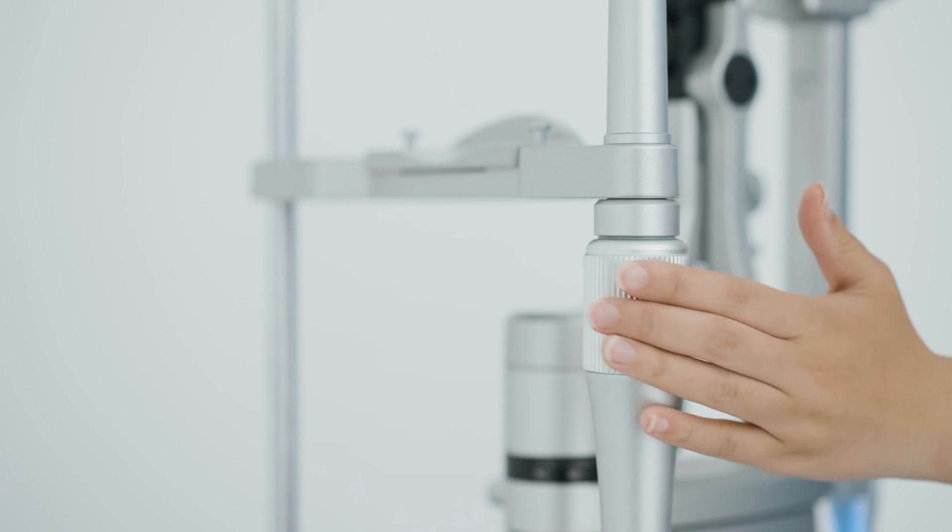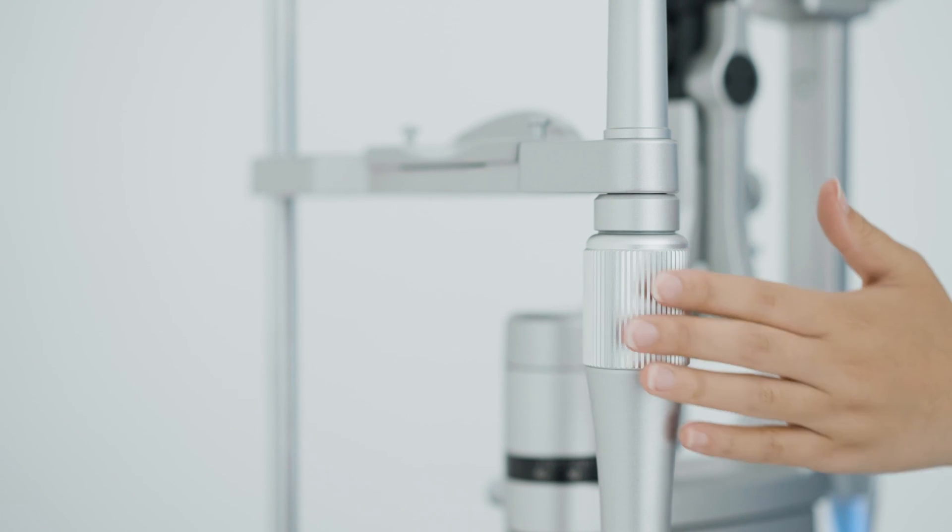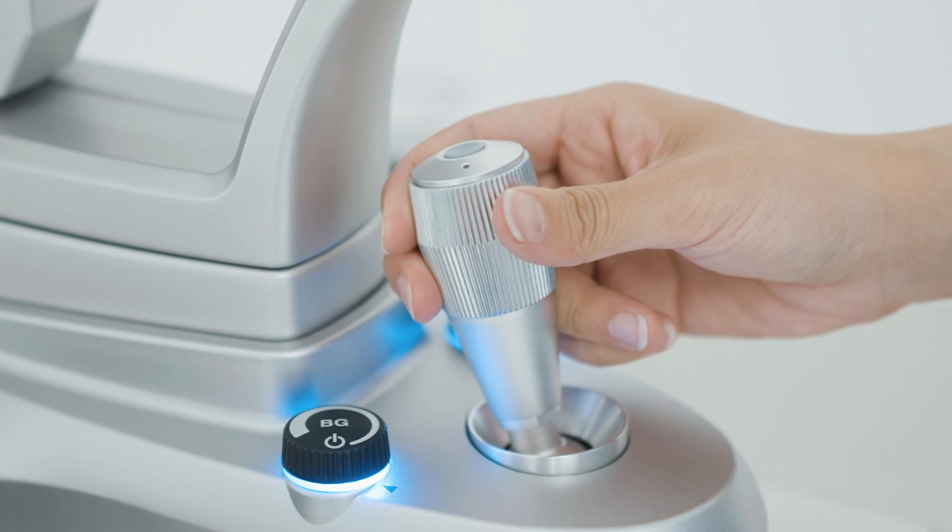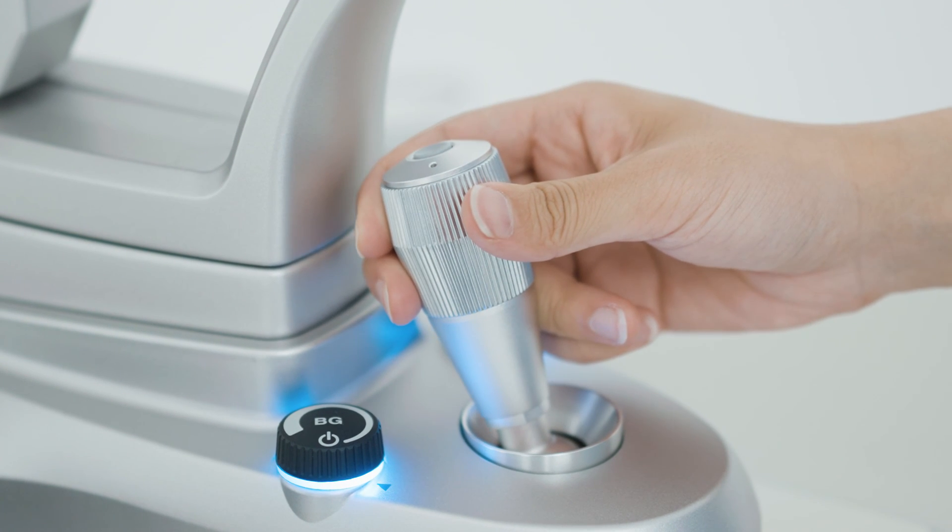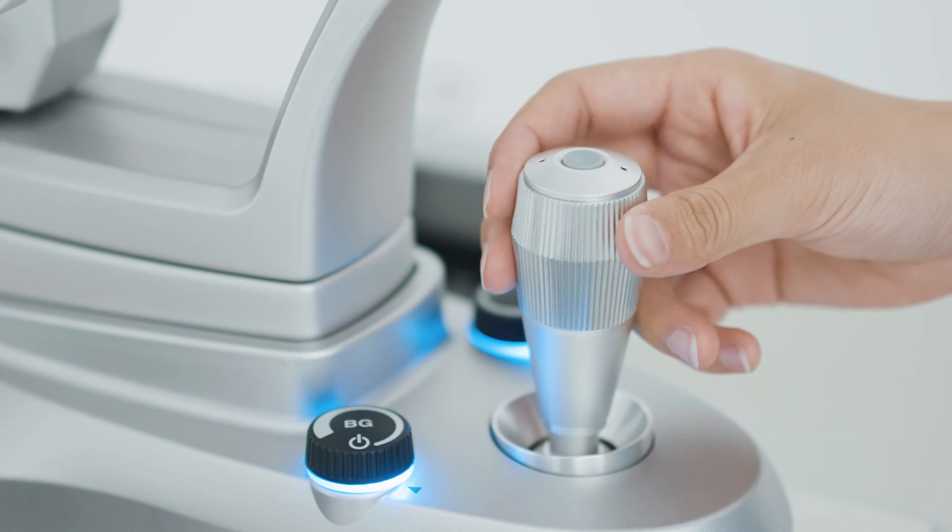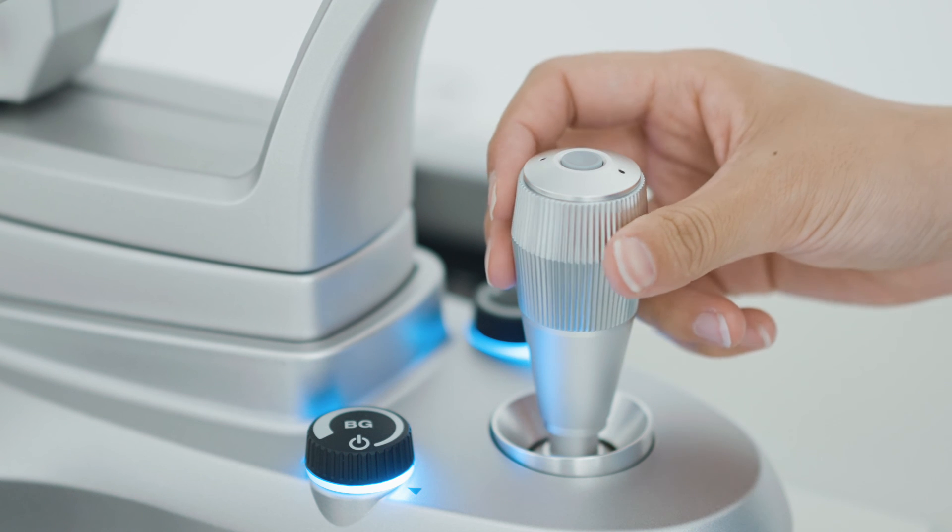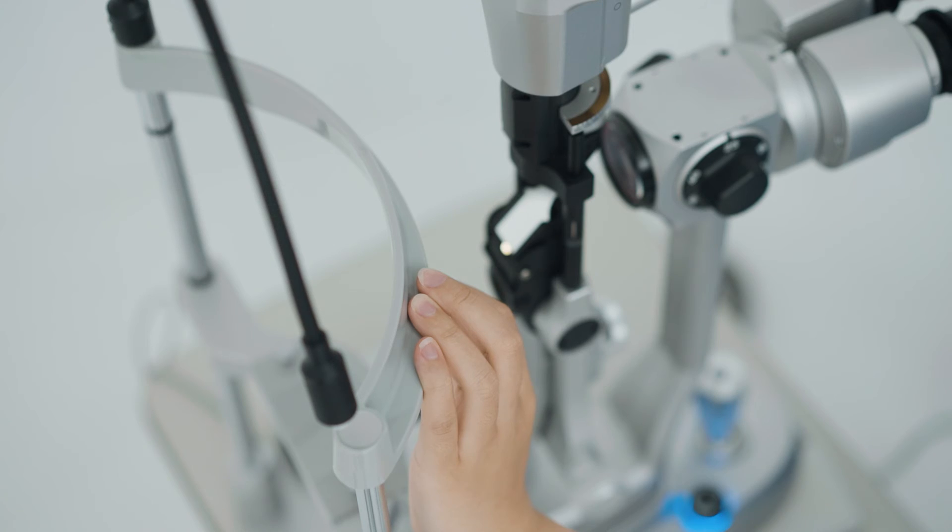Takagi's slit lamps have earned a reputation for their sophisticated design, high usability and variety of functions for everyday examinations.